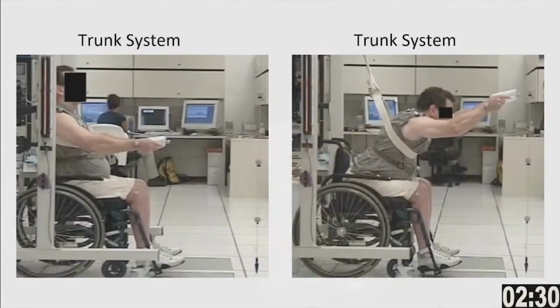These muscles are still capable of providing movement. They just lack the proper commands from the brain. A small electrical current, when applied to the nerve, can cause these muscles to contract again. Then it's my job to figure out how to control these electrically activated muscles by determining when and how strongly to contract them in order to obtain a certain trunk movement.